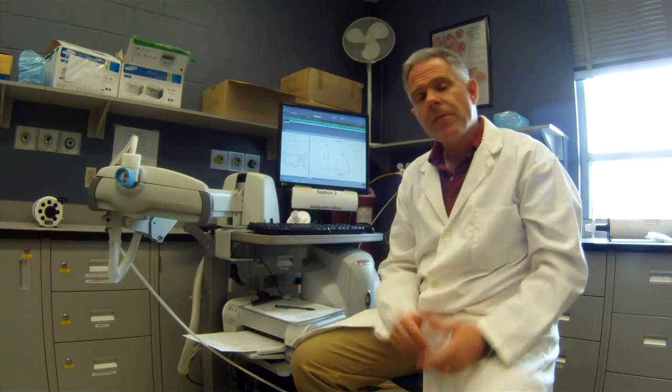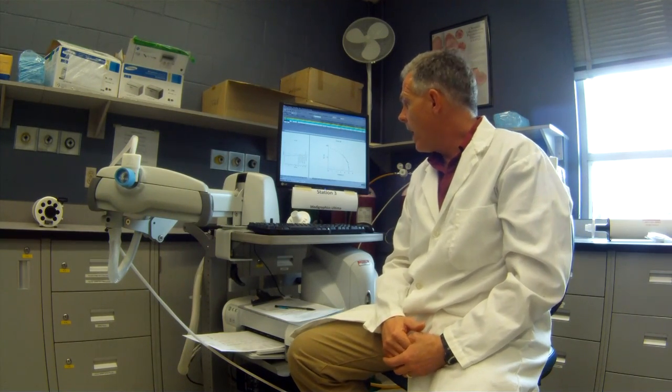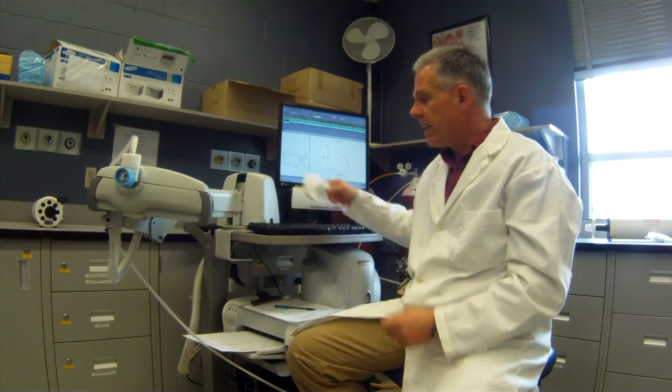Hi, my name's Alan Prost, and this is the fifth part in our series about how to perform pulmonary function testing. In this case, we're going to be doing a functional residual capacity measurement, so a volume measurement, using nitrogen washout. So, how do we coach a patient to do this?